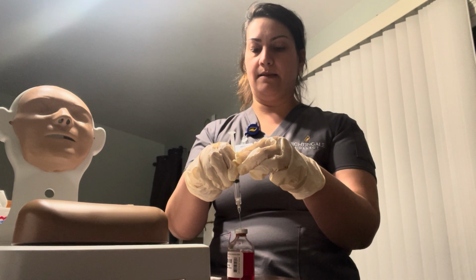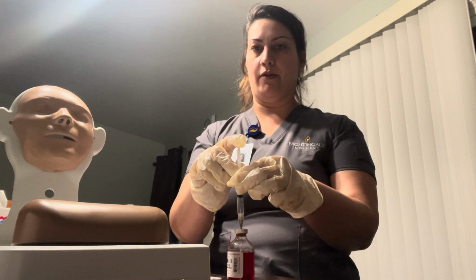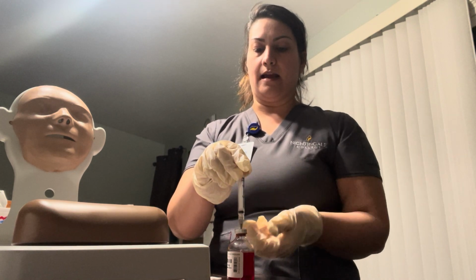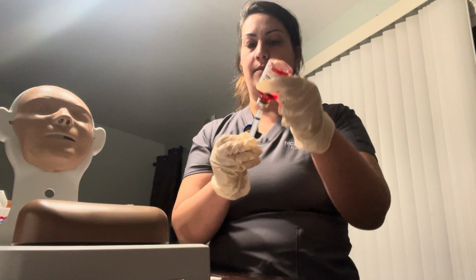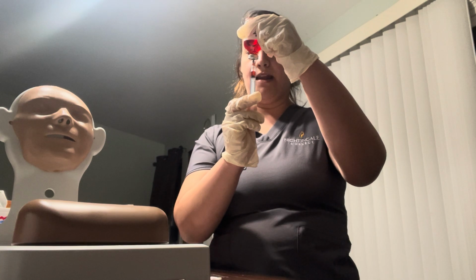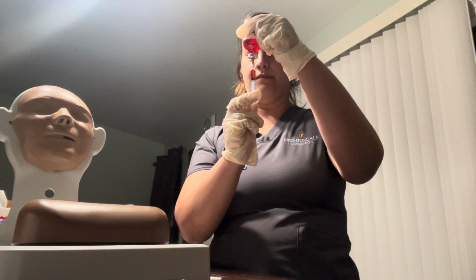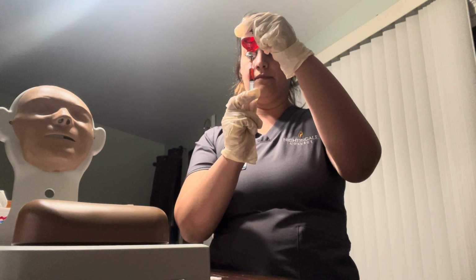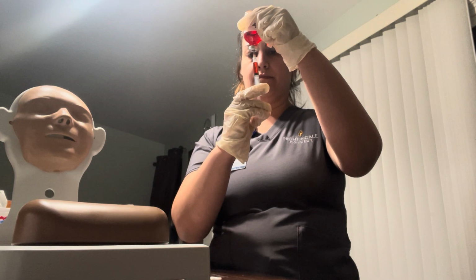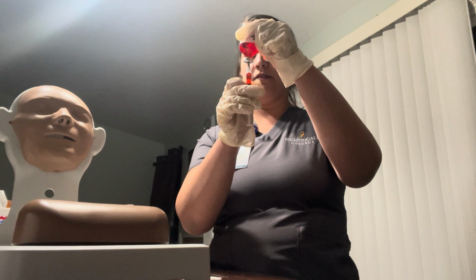I will place the needle in my vial. I will put the air back in, and I will pick up my vial upside down, and I will draw up my medication. I will tap to make sure that there are no bubbles.